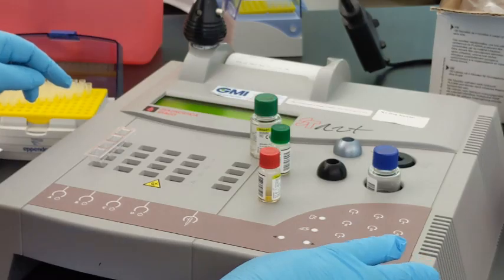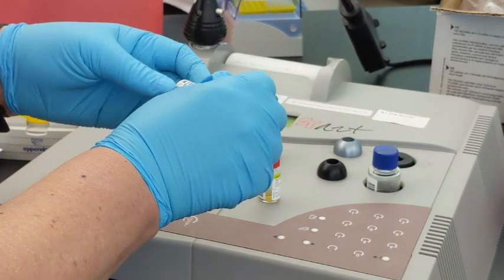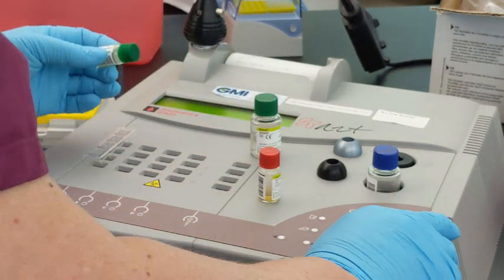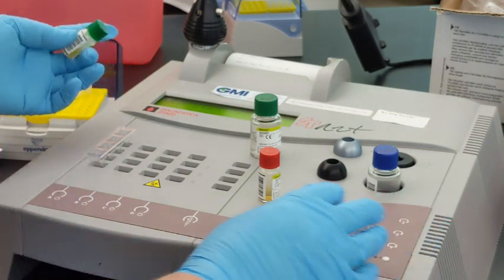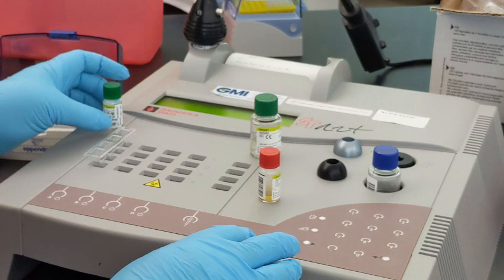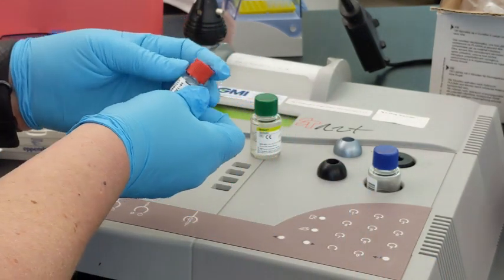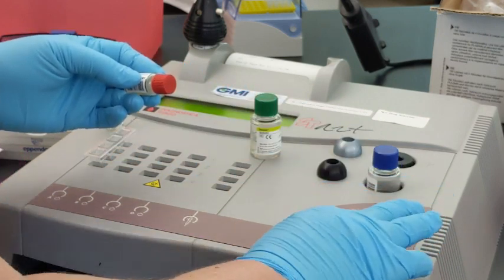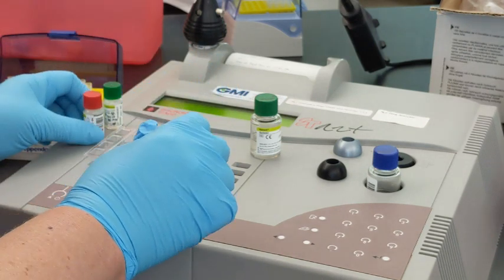And we hit enter, and then our first patient, or in this case our quality control, is 6957. And again, the computer knows we're going to do it in duplicate. And then patient 2 is our high control, which is 7117, enter. And again, it knows that we're doing it in duplicate.